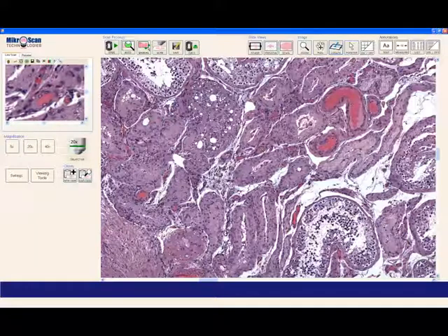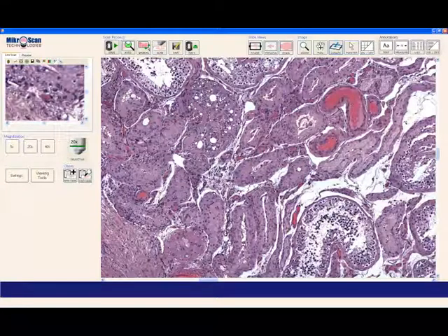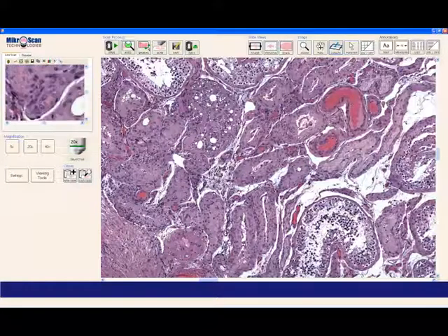A somewhat unique feature to the Microscan is the Locate button. As long as your slide is on the unit, this allows you to move your slide to get a high magnification live video preview of wherever you point to on the entire slide.